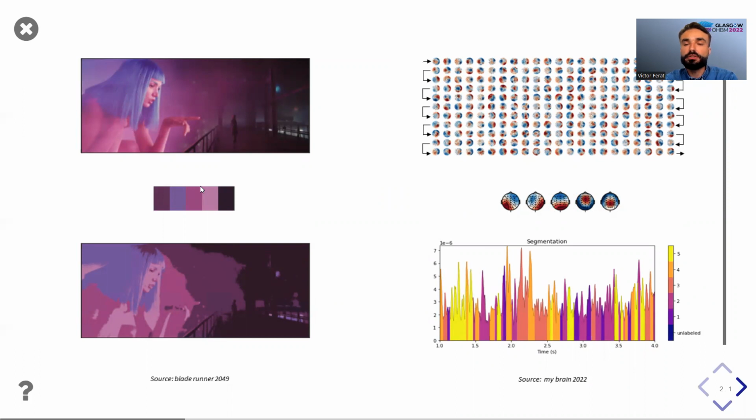For this, we can use the modified K-means algorithm that will find the centroids of the colors. Once we have these colors, we can transform our image into another image that only uses these colors. As you can see, we lose a lot of information, but the general idea of the data is still here. We can recognize the image.